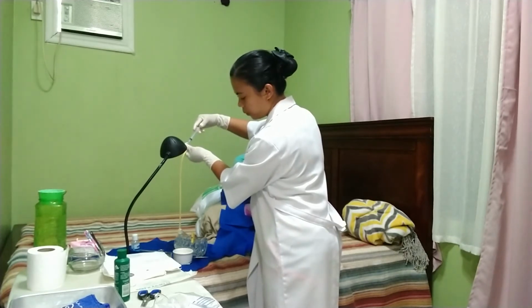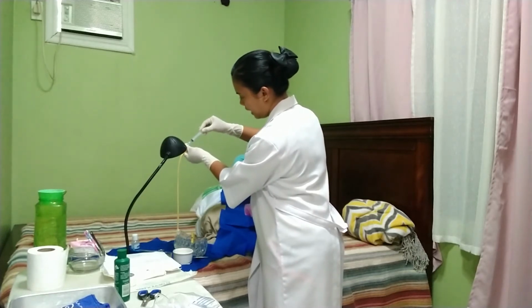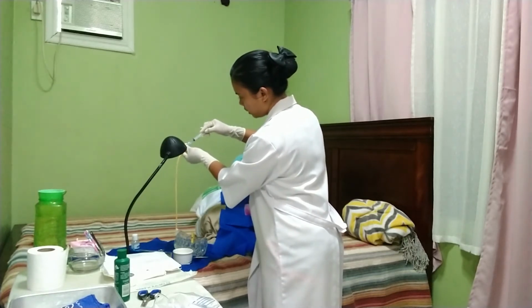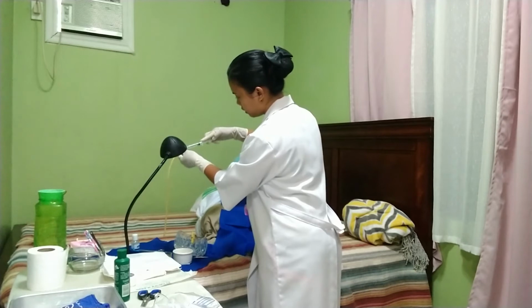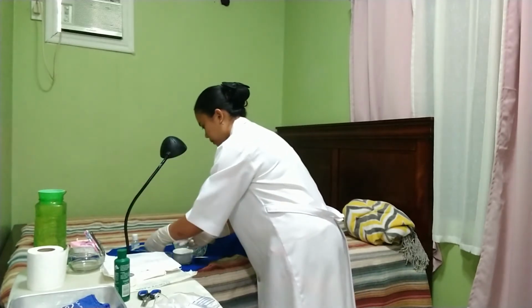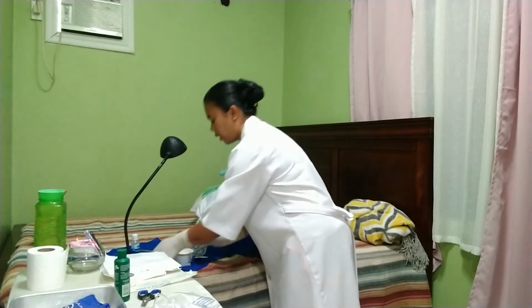Alright, so now that we have verified that the catheter is free from any defects, we can withdraw back the water that we have injected inside the balloon. And then place it right here. Place it back on our sterile field.